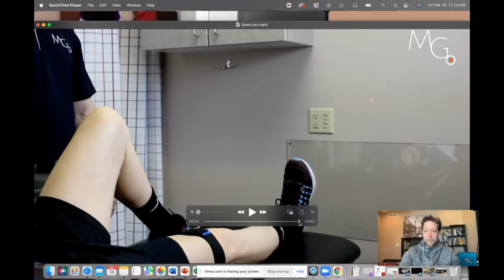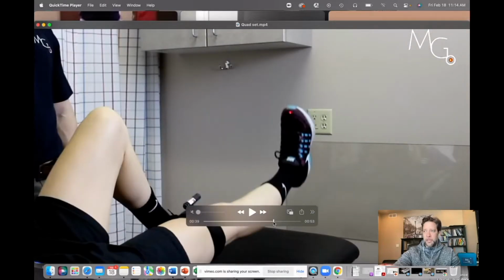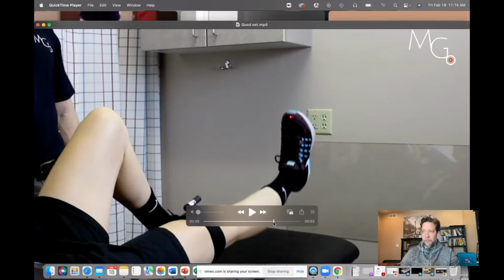Now, the second thing that can happen is when they go through their leg raise, as they come back down, that's going to be a tough challenge for them to maintain it on their foot, and they'll start to see the laser move off. All of these examples are going to be highly motivating for the patient. So if a patient can understand where the deficiencies are, then they can maximize their effort to correct these, and then maximize their efforts and efficiency for each session that they're going to be performing this exercise. All right, so that's quad setting and combined leg raising for your post-operative patient. And of course, you could use this for just anterior knee pain as well.